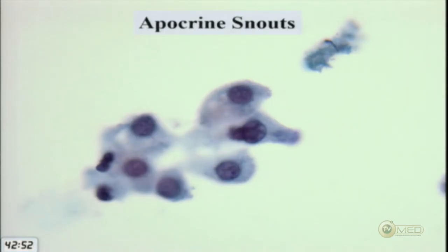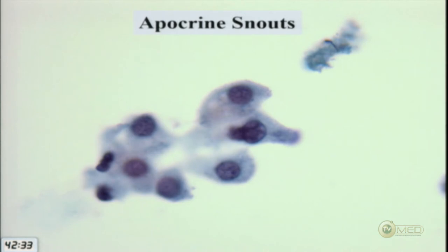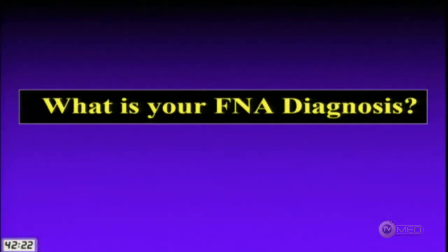On a liquid-based preparation of the salivary gland FNA, we again have bland, loosely cohesive cells. Some of these cells had little snouts on them — reminiscent of apocrine change. It's a very strange combination: epidermoid cells, secretions, something that looks cystic, clear cells, and apocrine cells.